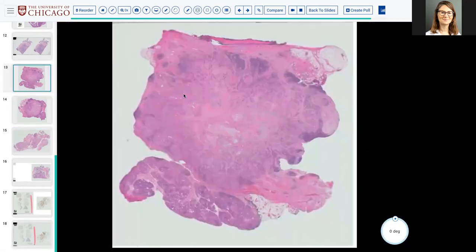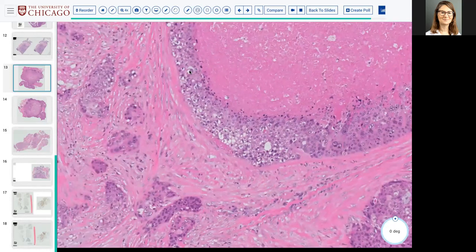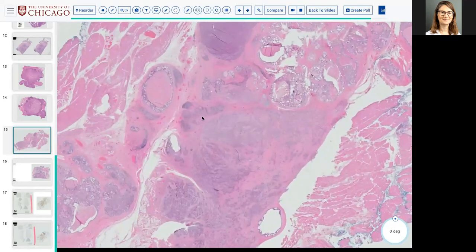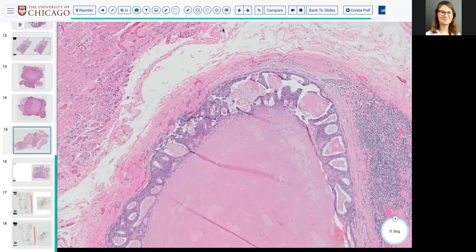Versus this high-grade mucoepidermoid carcinoma, in which the cells at the periphery don't really create that Roman bridging structure, but they do have central necrosis. All of these are invasive, and all of the invasion, even in these large nests, can be demonstrated by essentially the absence of a P40, P63, SMA positive myoepithelial layer at the periphery.